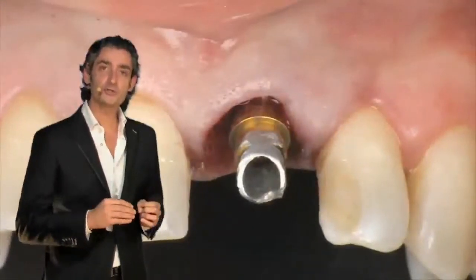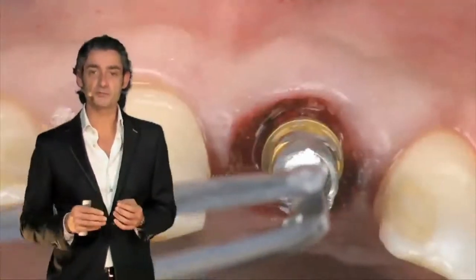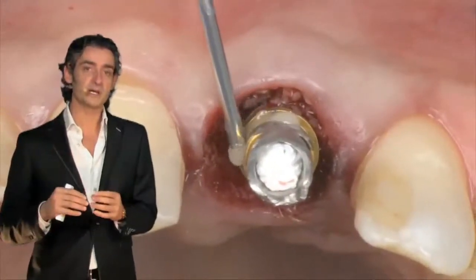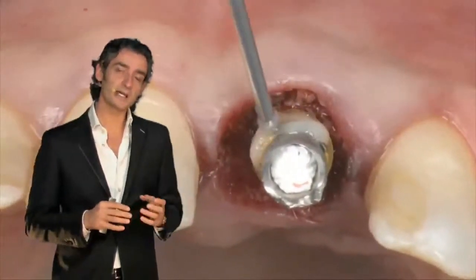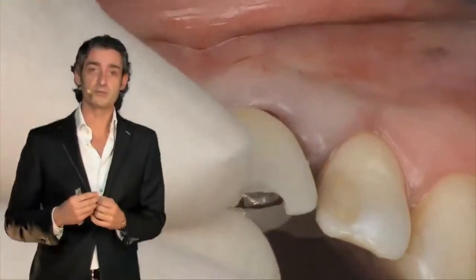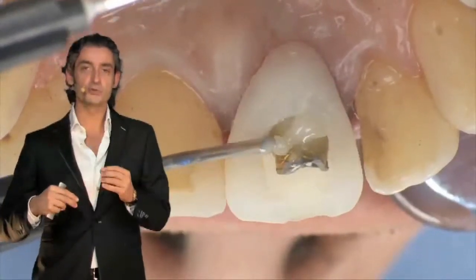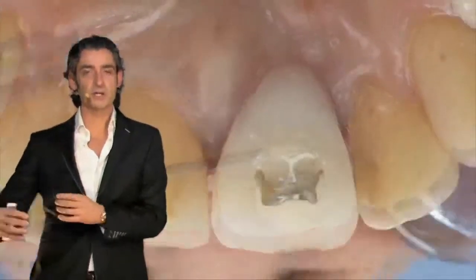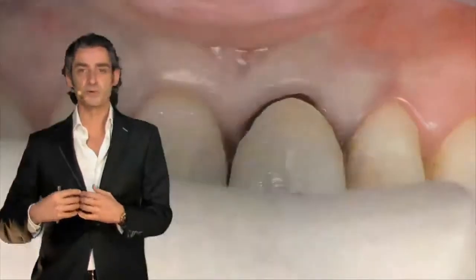For me, it's mandatory to avoid the plastic temporary abutment in these cases. And right now I'm trying my temporary, and then using some flowable composite, I normally fix my restoration in the right position, and then as I showed you before, I finish this provisional restoration outside of the mouth, never inside, because if you start to put any kind of resin, you can leave some reminiscence over there, some kind of contamination of our graft, and in some way it's not the perfect way to do that.